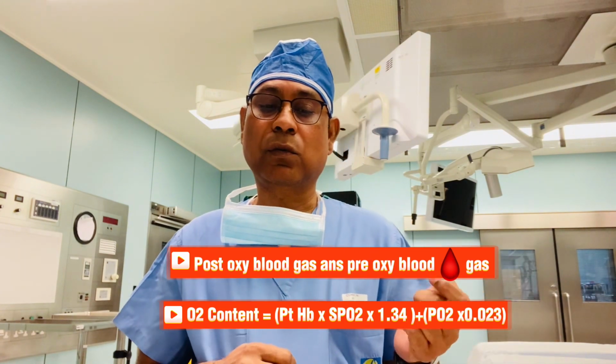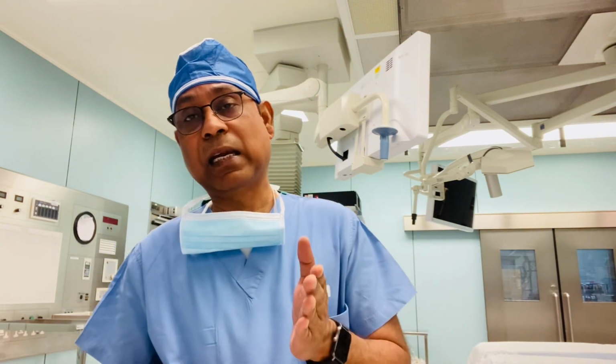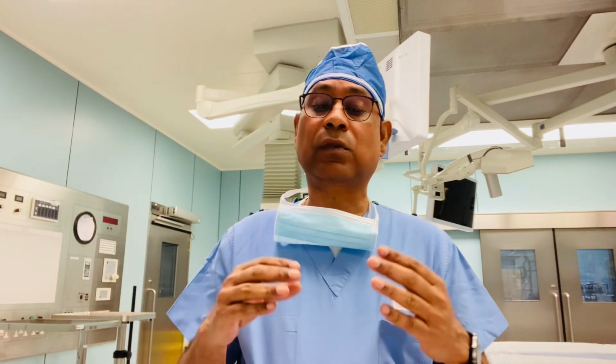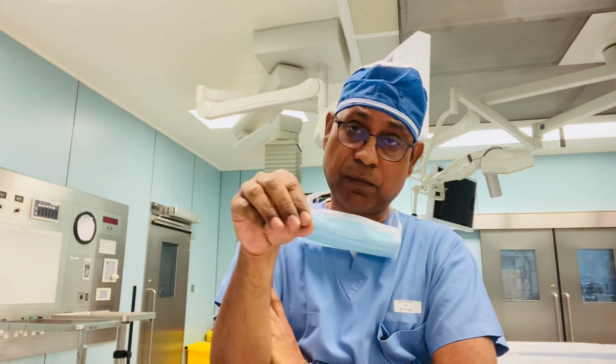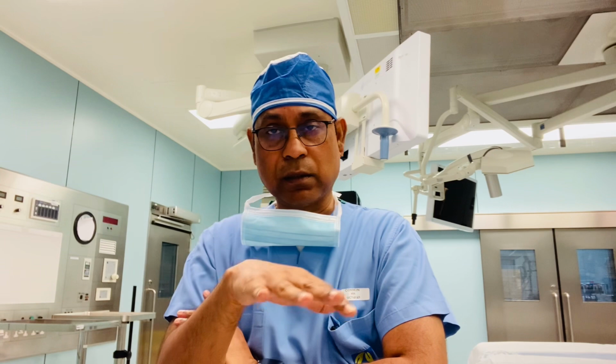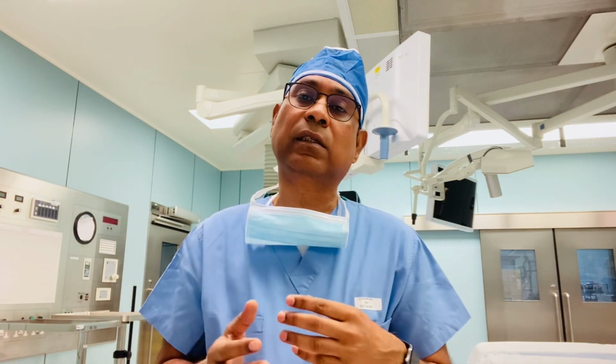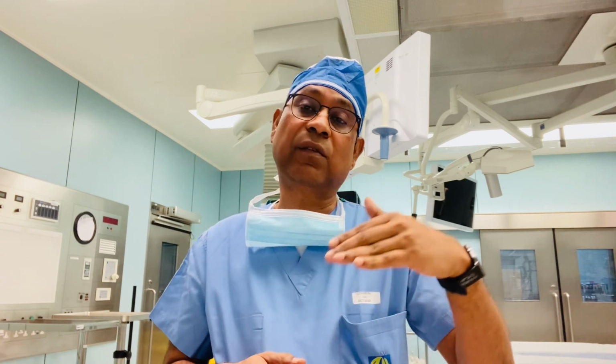Then post-oxy minus pre-oxy, times 10, which is the constant, times the ECMO circuit flow. If your ECMO pump flow is running at 3 liters or 4 liters, you put the same value in the formula. Once you put in all the values, you will get a number. Each oxygenator has different gas transfer equations.